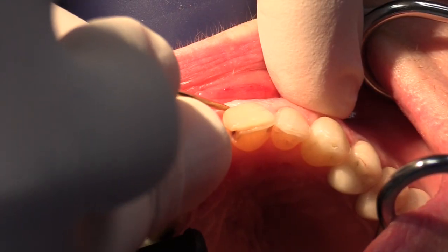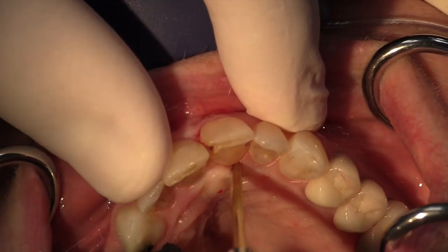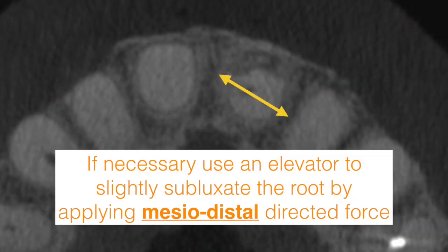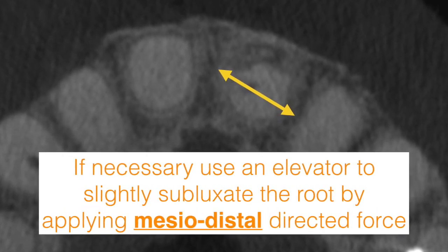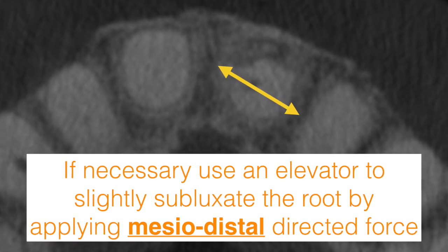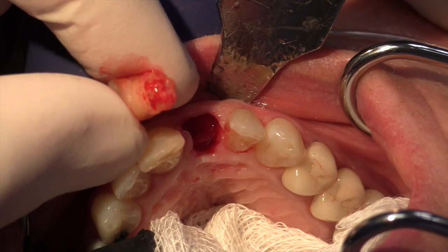Instead, here we'll first use a periotome to disrupt the gingival attachment. Depending on the length of the root, the density of the bone, and the stability of the root, it might be necessary to slightly mobilize the root using a mesiodistally directed force with a small elevator. Also, the coronal aspect of the tooth must be removed until the root chamber and the canal is reached.